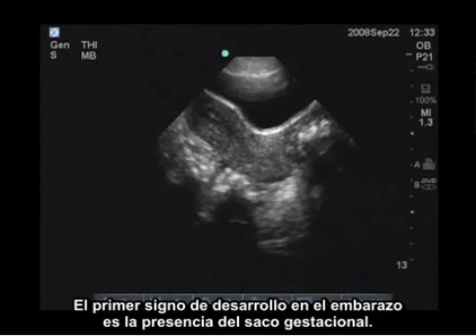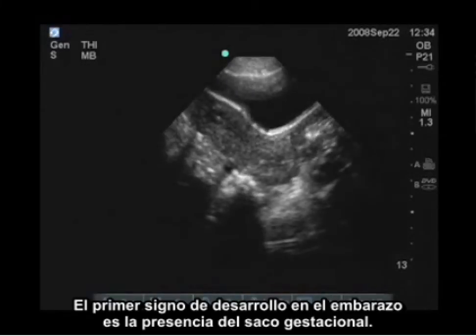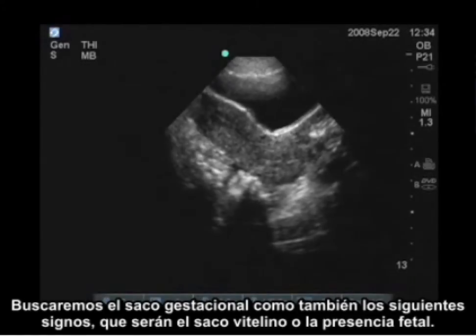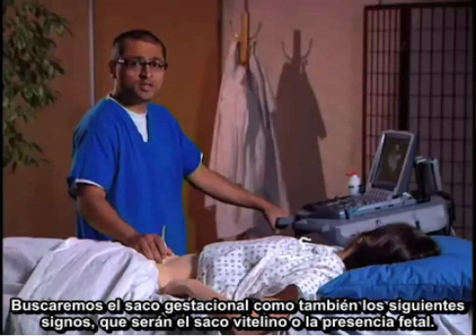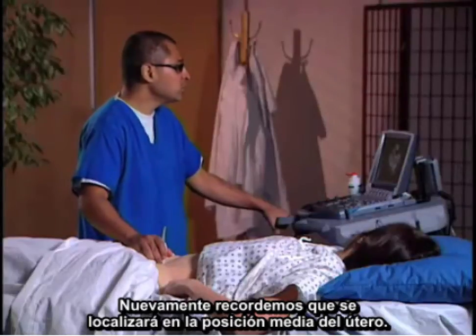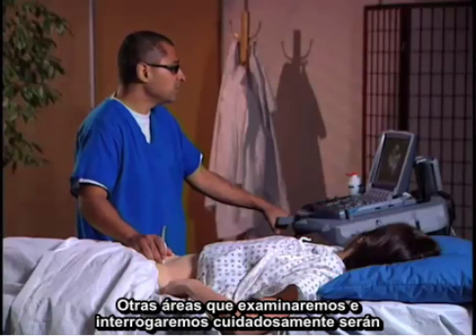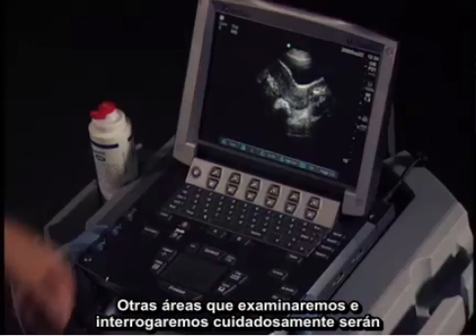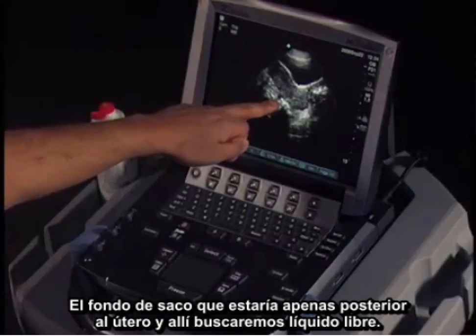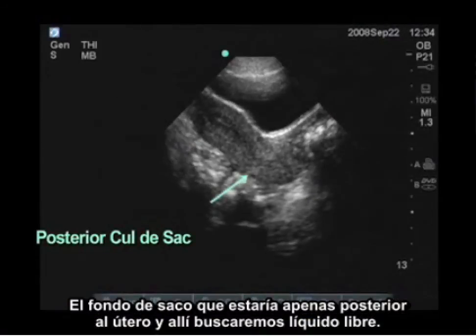The first sign of a developing pregnancy is a gestational sac. We're going to look for a gestational sac, as well as the next subsequent signs, which would be a yolk sac or a fetal pole. Again, these would be located in the mid-uterine position. Other areas that we're going to carefully examine would be the cul-de-sac, which is just posterior to the uterus, where we look for free fluid.